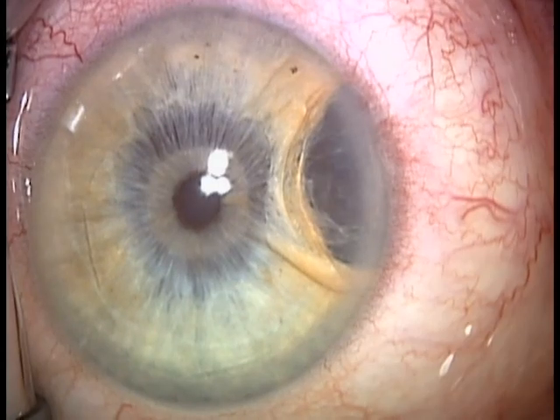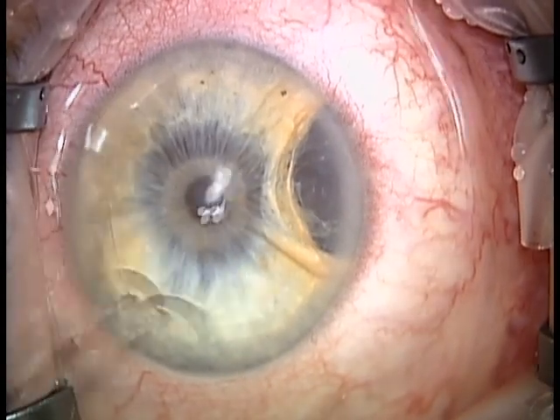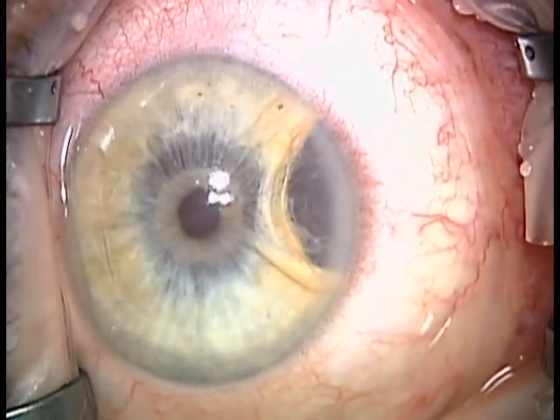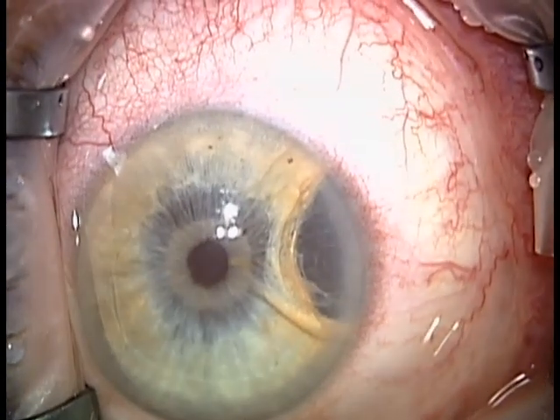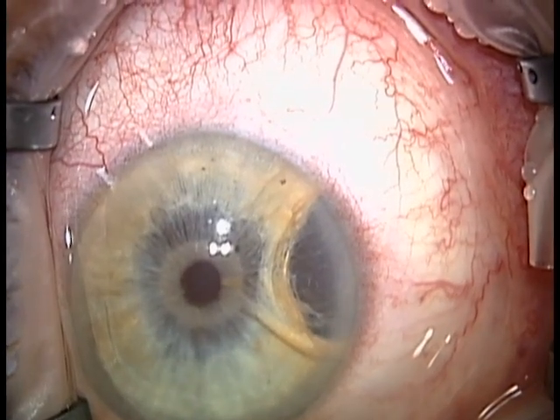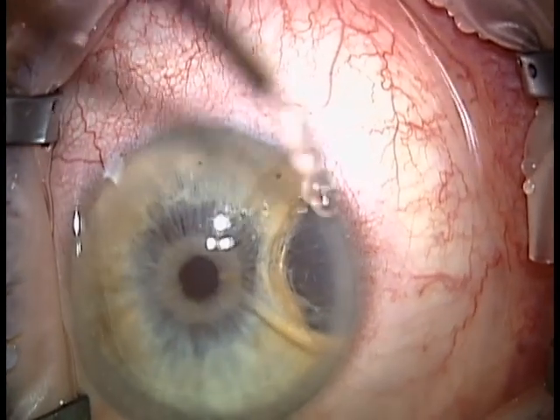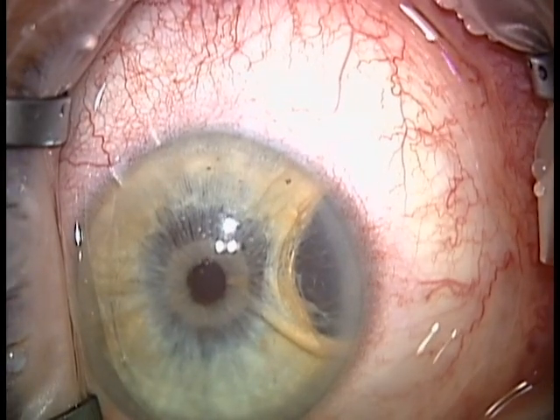This is a typical epithelial implantation cyst following cataract surgery. At some time during the procedure, epithelium was introduced into the iris stroma and a cyst formed. Management of these cysts can be done in a number of ways, but the method I'll be presenting in this video is intracystic alcohol injection using ethanol.